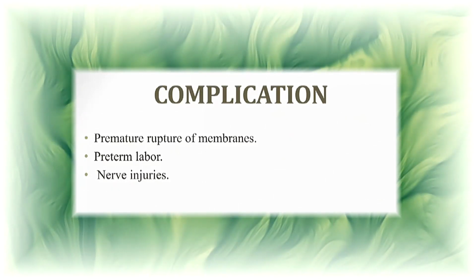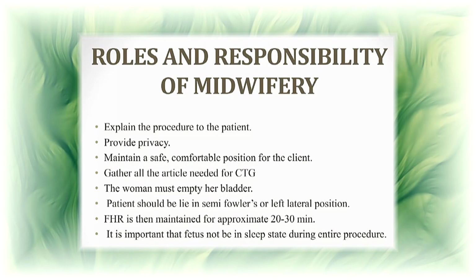Next we'll see the complications of CTG. These are premature rupture of membrane, preterm labor and nerve injuries. Lastly, we'll discuss the roles and responsibilities of the midwife. These are: explain the procedure to the patient, provide privacy, maintain a safe, comfortable position for the client, and gather all articles needed for CTG.